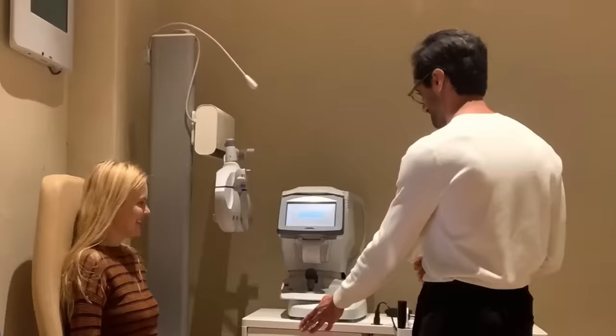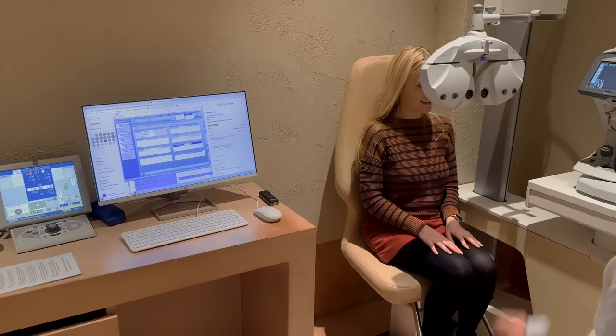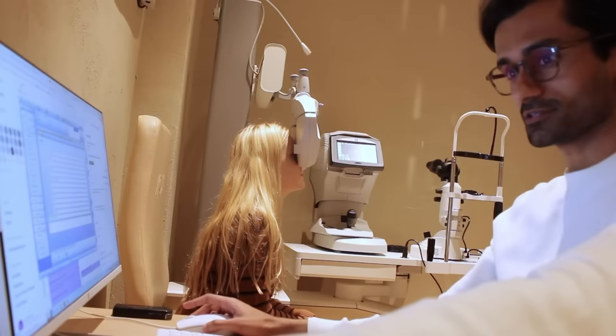Yeah. So what I'll do now, if I pull this up in front of you, I'll put in here what your current glasses are. You said minus one in both eyes. Yes, I believe so. And then we'll see where we end up. So if you push your head against that for me, please. That's it. Is the height okay? Oh, yeah, it's good. Awesome. So I think let's maybe start with what you can see without any glasses. I've covered your left eye, I've gone with the right eye. Could you read those?